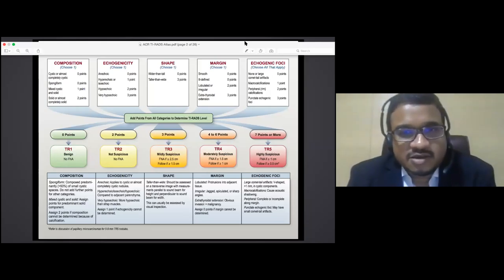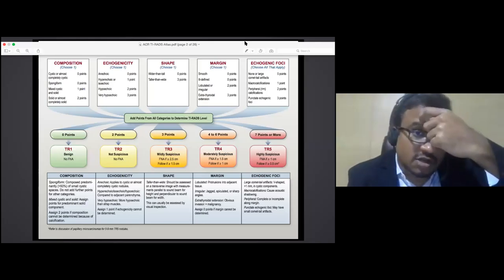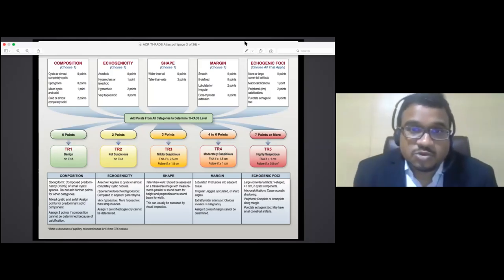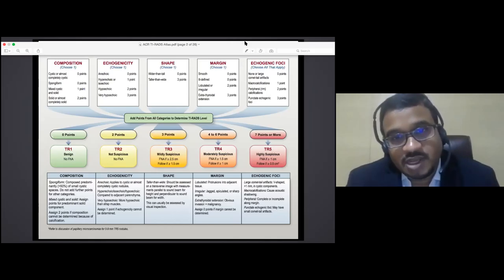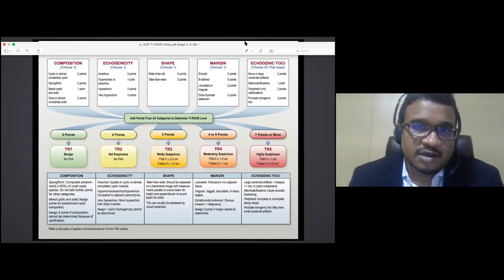So here, the purpose of this course is not to replace the radiologists or anything. Surgeons, physicians, and endocrinologists who are dealing with thyroid glands every day should be able to interpret the ultrasound images by themselves. Ultrasound is like a third hand for physicians dealing with thyroid disorders, or I can also say like a stethoscope for the cardiologist, or an echo for a cardiologist. So everyone must have it in their clinical practice.